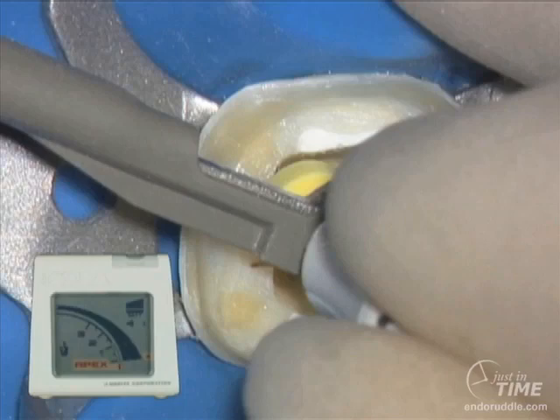Here you're looking at J. Morita's Root ZX, and this is the most popular apex locator in North America today. Notice the digital display is fully illuminated to apex.